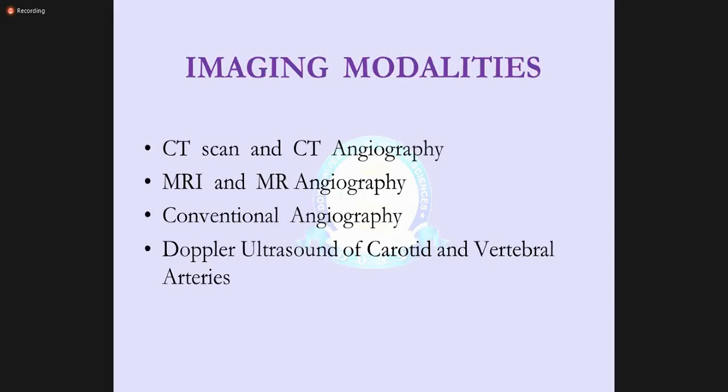What imaging modalities do we employ to investigate it? CT scan and CT angiography, MRI and MR angiography, conventional angiography, and Doppler ultrasound of carotid and vertebral arteries.